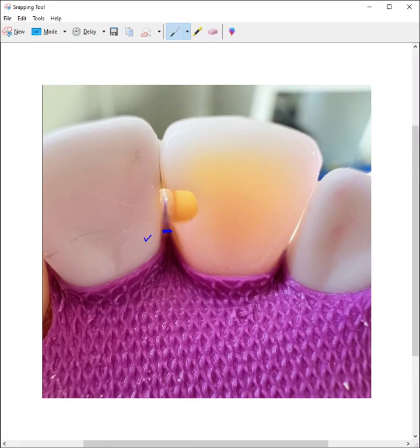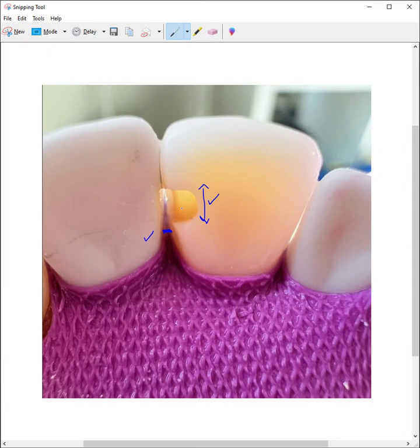Check on that. Check on the dimension this way. And just watch this. This distance should be 1.5. So I don't know if you're a little bit overextended.